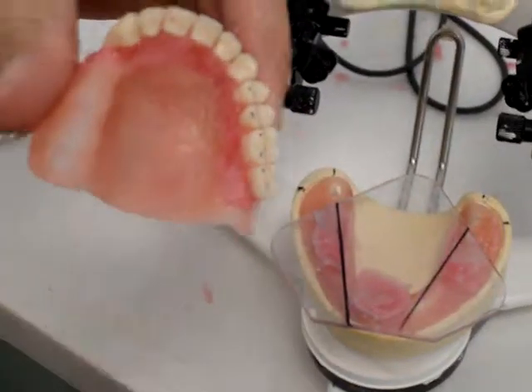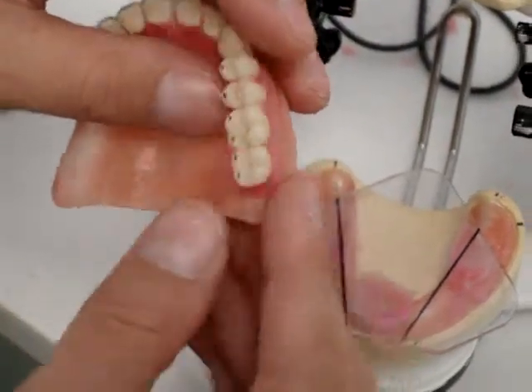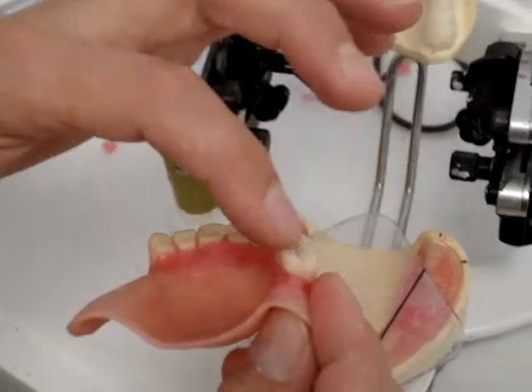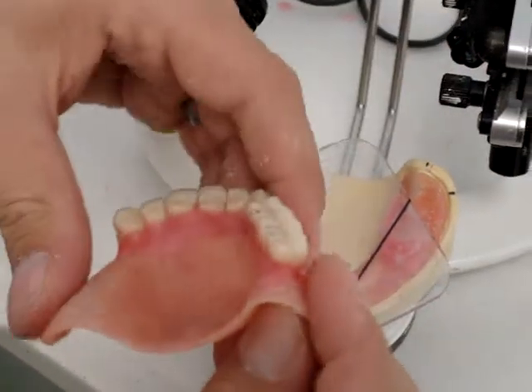Okay, so now with the second molar, it's very similar to the first molar. Make the dots, get it set on there, lute it down, and then you want to look and make sure, again, that the cusp tips are lined up in a nice straight line, central groove, and the buccal cusps.